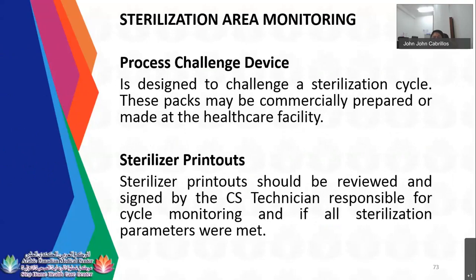Sterilizer printouts, once it is done, your main responsibility is to check the receipt or the printouts. You need to check the temperature if it reaches 121 to 135 degrees. Okay, you need to check the drying cycle. You need to check the consistent temperature for the steam exposure. So you need to check the sterilizer printout before opening the machine.